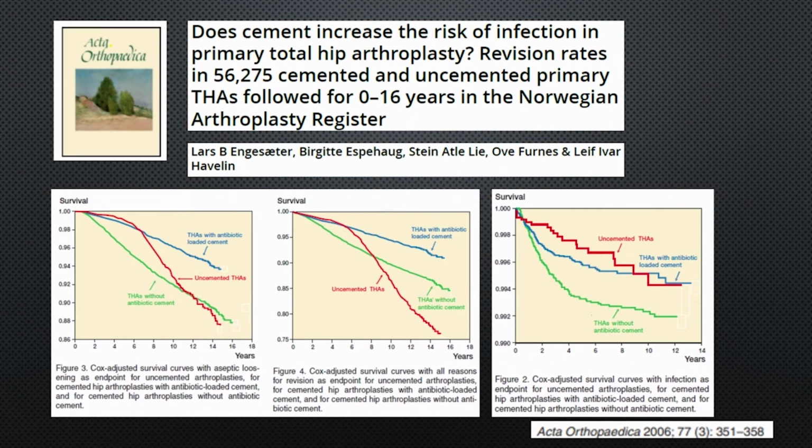They got the answer that was on the right-hand side graph, which basically says that, if you use antibiotics in your cement, then it's about the same as using an uncemented implant. But in Norway, you can also see that if you use an uncemented implant, long-term survivorship is not so good. So what are your comments about that, Niels?